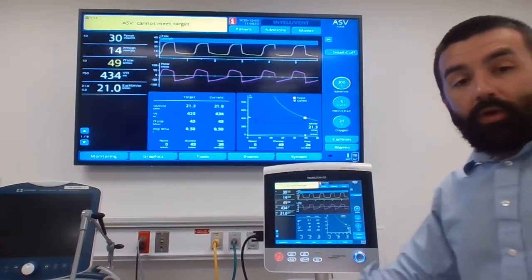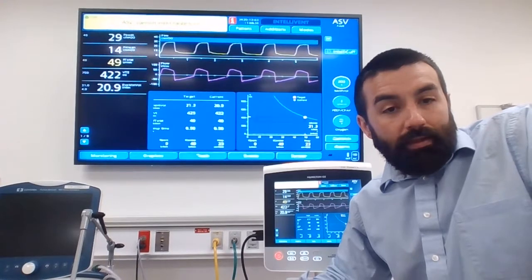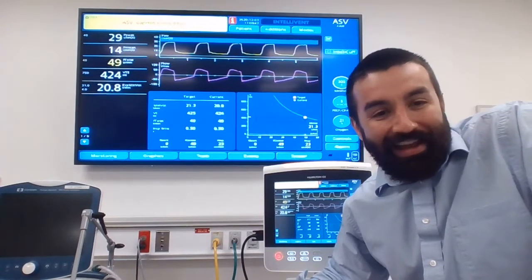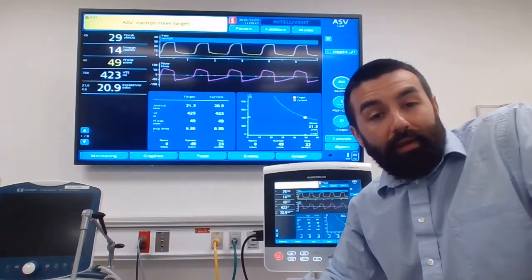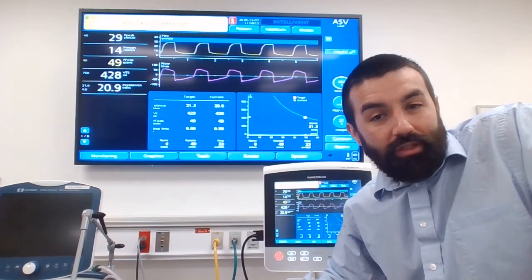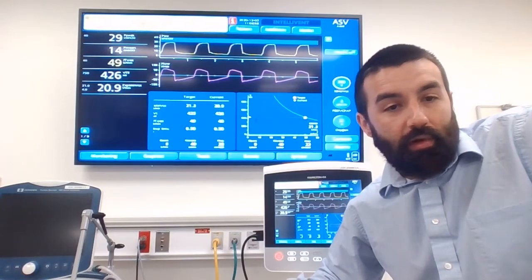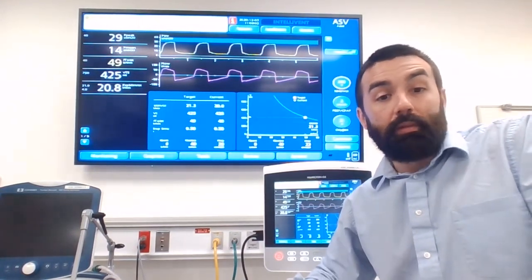All right. So, lastly, let me tell you my parting words about ASV. You could consider this a form of automated ventilation, or IntelliVent, or artificial intelligence, whatever. What I'll tell you about it is artificial intelligence is great when you're in situations where there's a lack of intelligence to begin with. So I'm not knocking ASV. It's very useful. Certain patients, it's great. It's more automated. It lets the ventilator make more rapid adjustments than what we would typically be able to make in a shift.